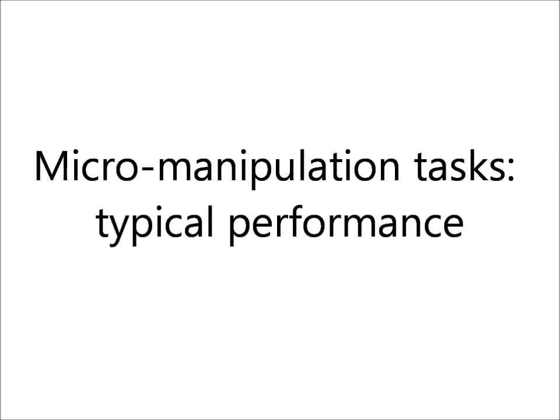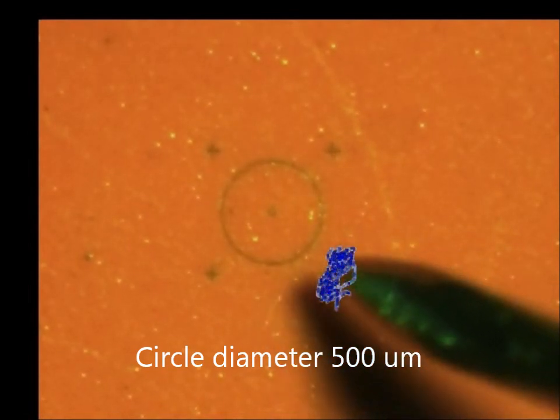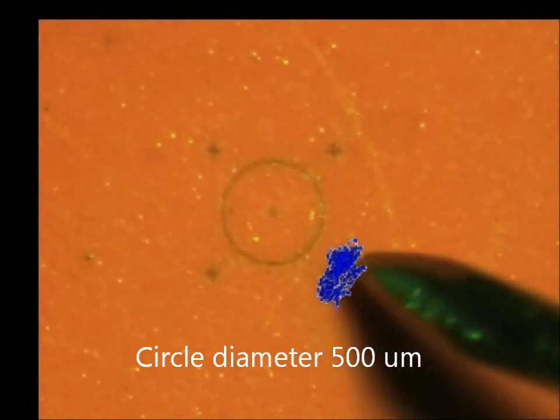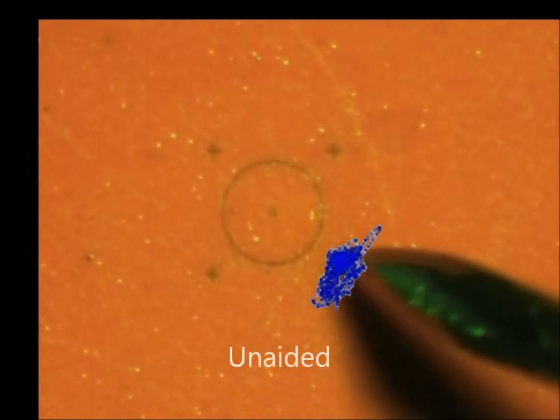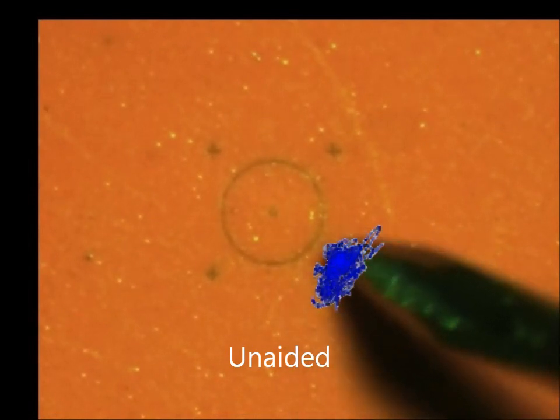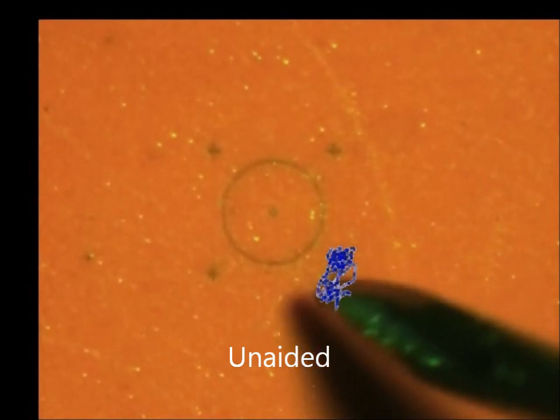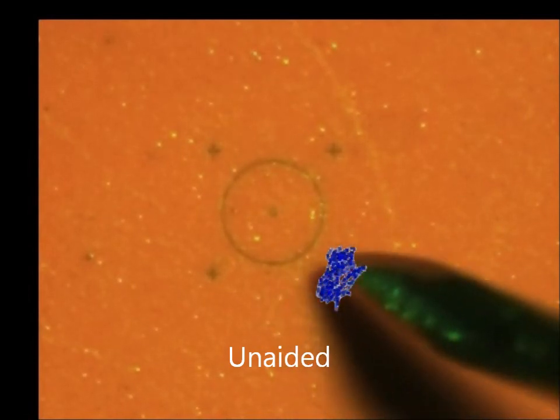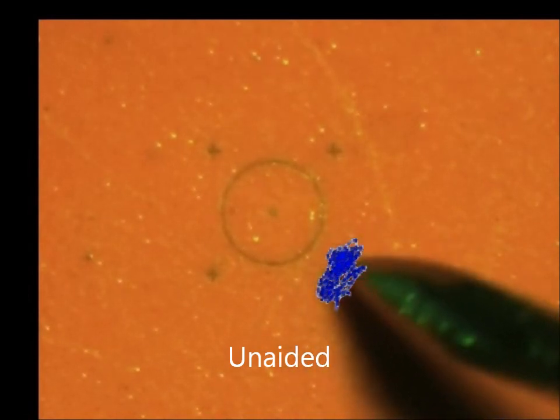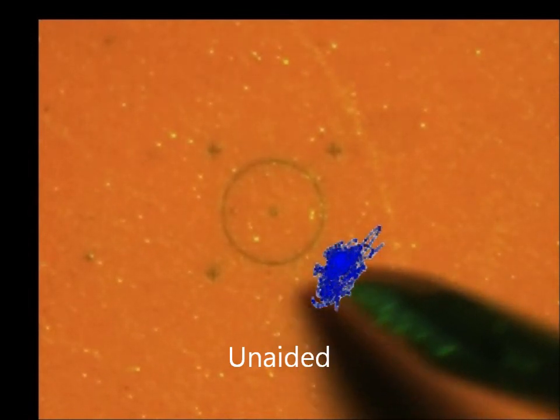We evaluated Micron's ability to improve accuracy in tasks that resemble microsurgical manipulations. The test target is rubber with a 500 micron or 1.5 mm diameter circle. The first task is simply attempting to hold the tip stationary. In this video, the tip trajectory is shown as a blue overlay. In conventional unaided operation, there is considerable rapid shaking of the tip. Notice how the tip sometimes presses into the surface, which would damage the patient's retina.